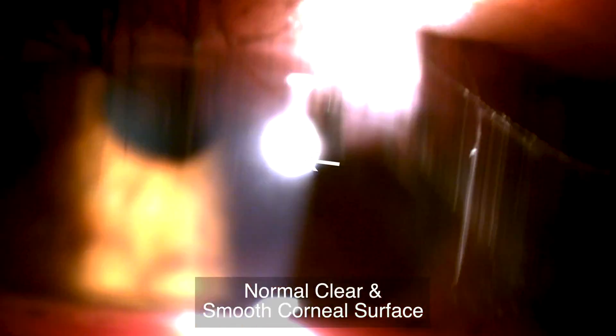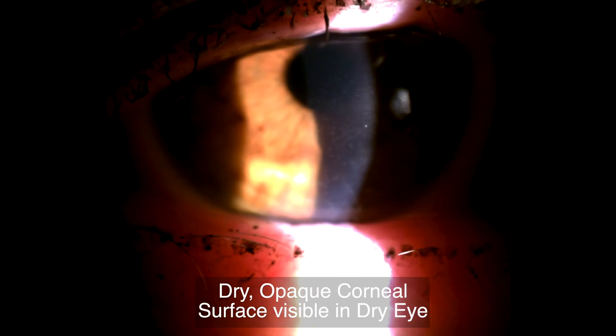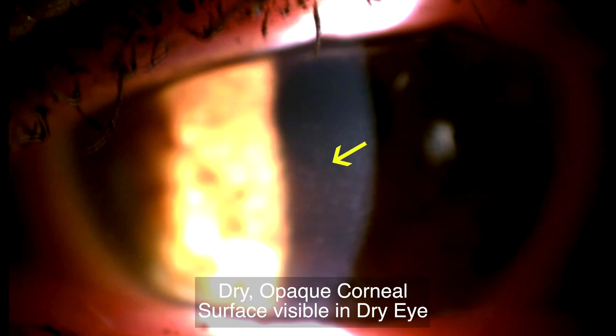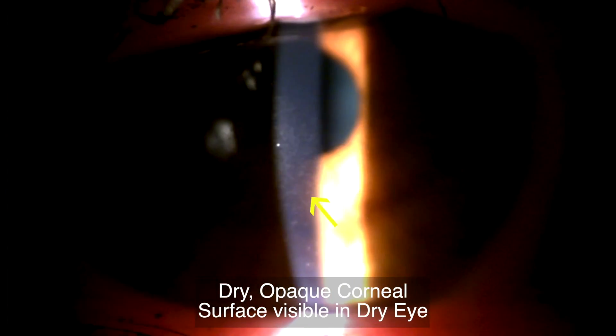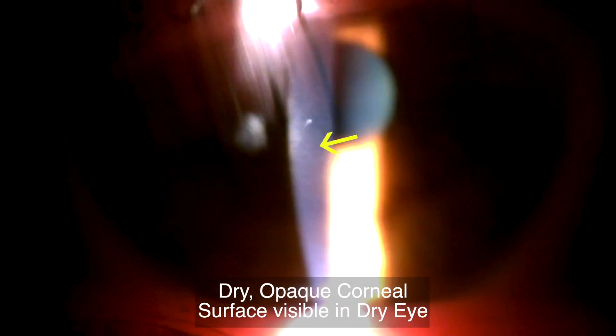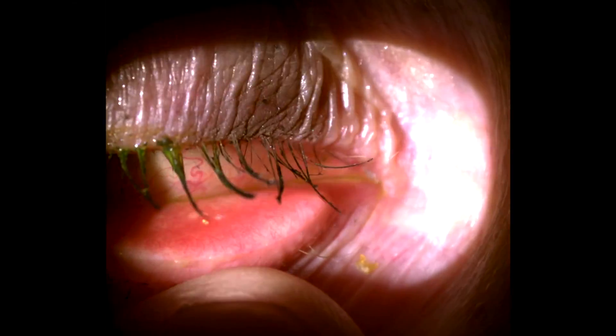Here we see a normal corneal surface. It is smooth and clear, like glass. On the opposite eye, we see small, opaque cells on the corneal surface. These cells are desiccated, causing the corneal surface to lose transparency and smoothness, thus reducing this patient's visual clarity.